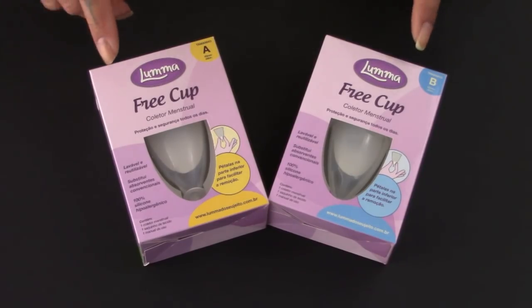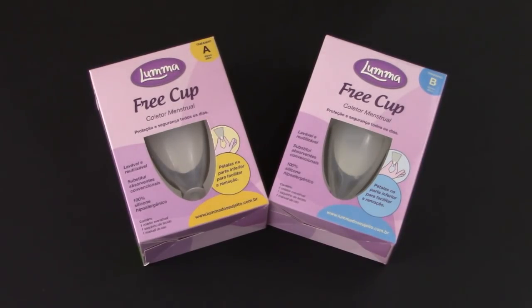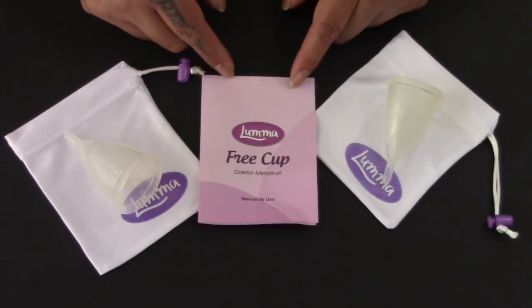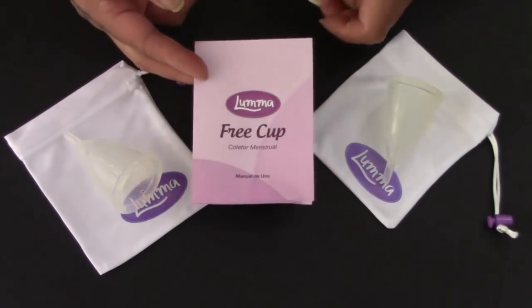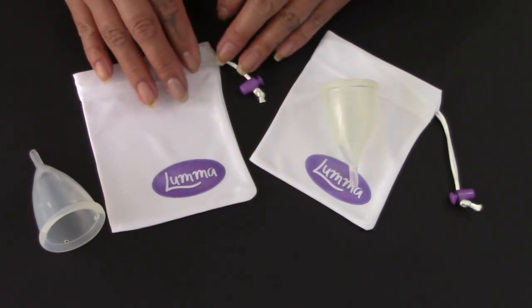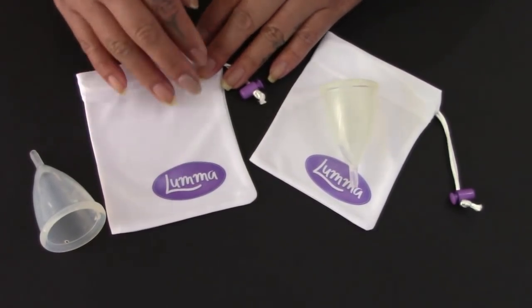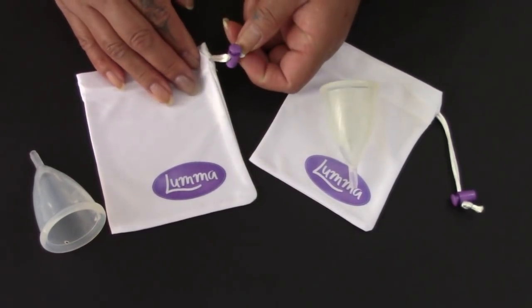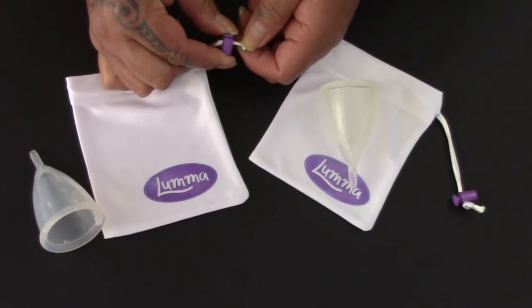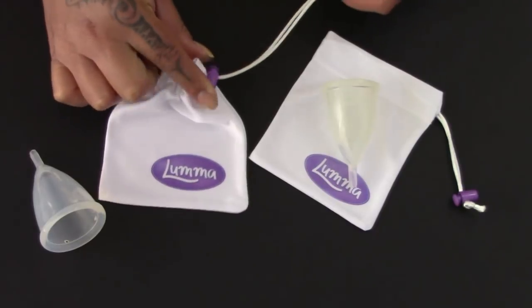Here are the two Luma free cups, which were made for someone with a high cervix. Each of the Luma cups comes with a pamphlet, but I believe it is also in Portuguese. Each of the Luma cups comes with its own pouch — I think this is a nylon — and it has a push button clasp. You push the top of it and then you can slide it and it cinches down.